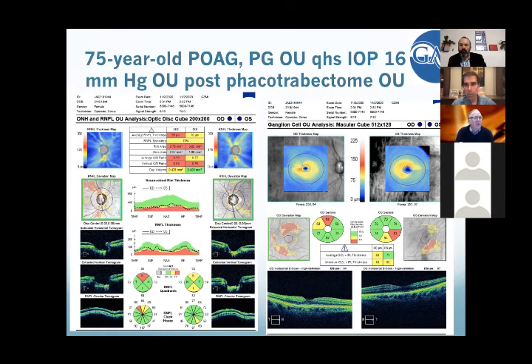But this patient's been a long-term patient, and if you look at the nerve fiber layer loss in the right eye, there's a significant area there that's for real. And not so much in the left, maybe a little bit in the left eye in inferior area. But certainly, you can look at that OCT, and it's pretty impressive as far as the right eye with loss superiorly.